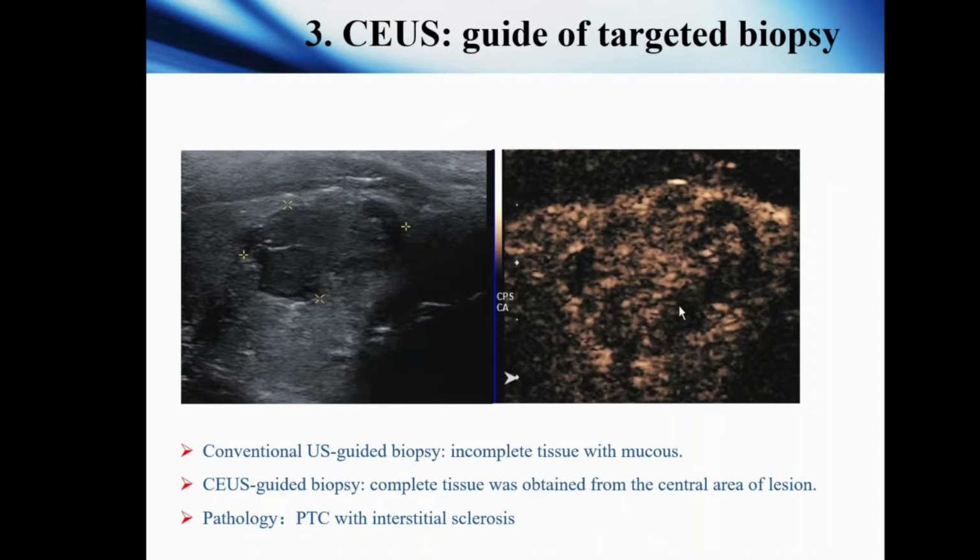In this case, conventional ultrasound guided biopsy couldn't get good tissue. The tissue is incomplete and has mucus.